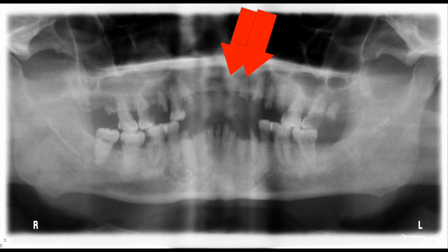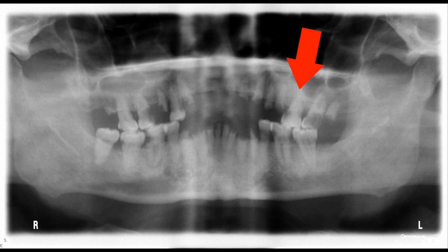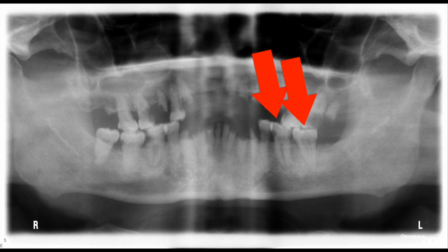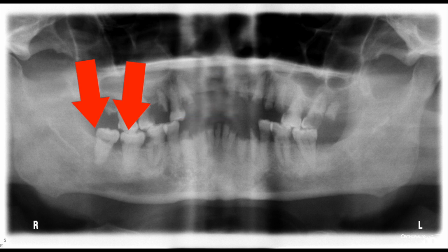7 and 8 not present, 9 and 10 present, 11 same issue, except we have a periapical radiolucency there as well, so it may be hard to numb that area. 12, 13 looks fine, 14 looks fine, 15 looks fine for the extraction, may fracture on us as well, 16 looks fine, 17 not present, 18, 19, that should be fine, 20, 21, 22, 23, 24, all the way to 29 looks fine, 30 may give us a little bit of issue, 31 and 32 look fine.